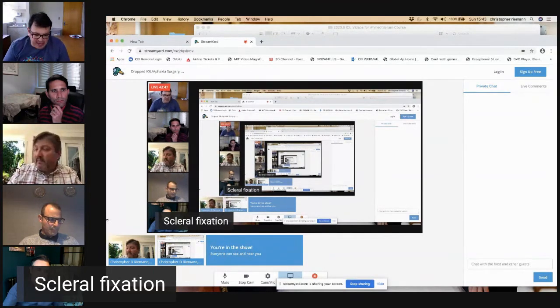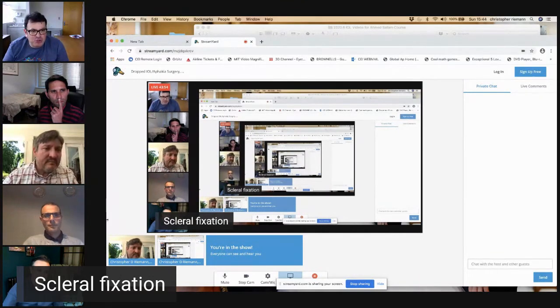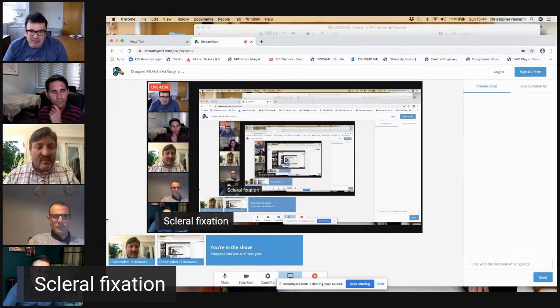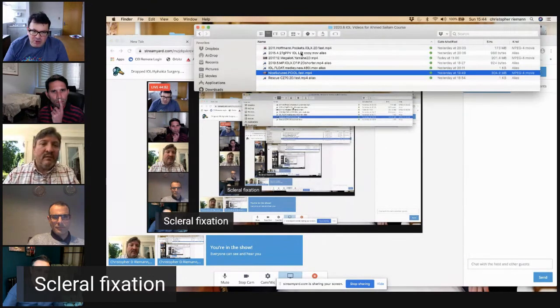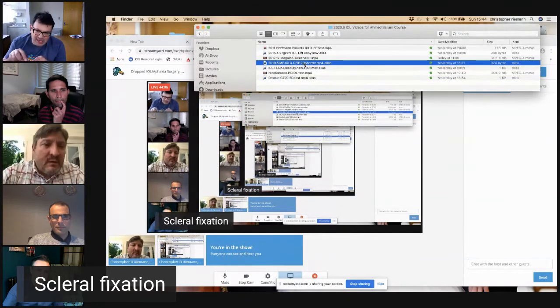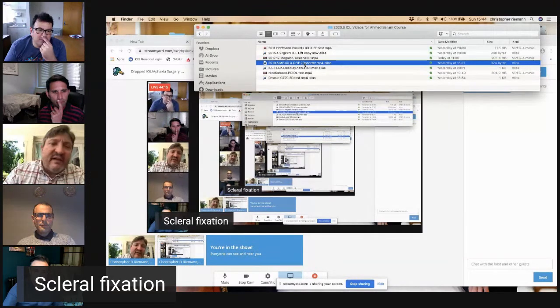I've tried this technique and it's really very nice, because the problem is the patients come complaining of the irritation from the exposed sutures under the conjunctiva, and the eye doesn't look very good. But maybe just my advice for starting surgeons, I don't know, Chris, if you agree, make at least a conjunctival opening on one side, at least a small one, because when I try to bury from no opening, in my hands it's difficult. It is definitely a little bit tricky.